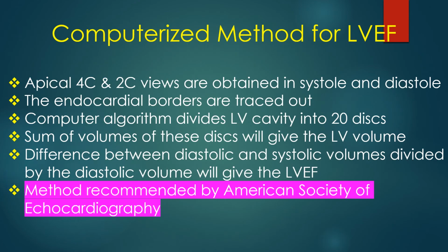In echocardiography, apical 4-chamber view and 2-chamber view are obtained in both systole and diastole. The endocardial borders are traced out. The computer algorithm divides the left ventricular cavity into discs, usually 20 in number. Sum of volumes of these discs will give the left ventricular volume.